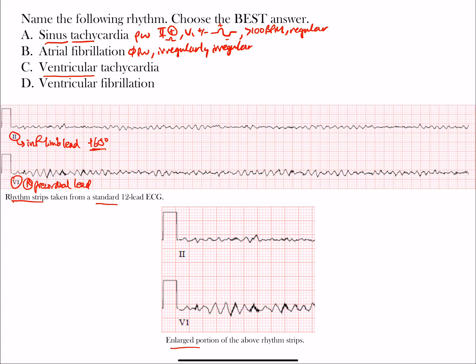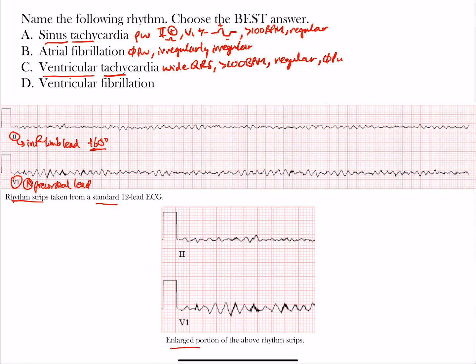Ventricular tachycardia, as the name says, is a ventricular rhythm — it originates from the ventricles, outside the normal conduction system. That's why we see wide QRS complexes, because you have slow cell-to-cell depolarization. It's also a tachycardia, meaning over 100 beats per minute, and it is a regular rhythm. There are no P waves, unless you have retrograde conduction. You can also see AV dissociation, which is a hallmark, though difficult even for experts to identify.